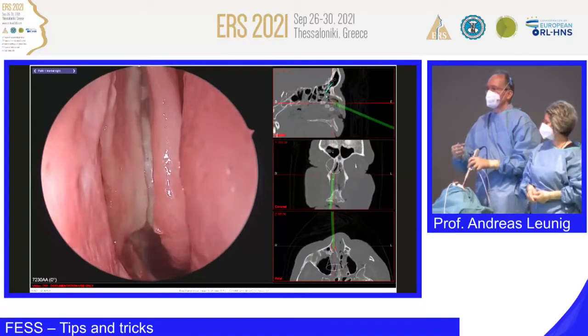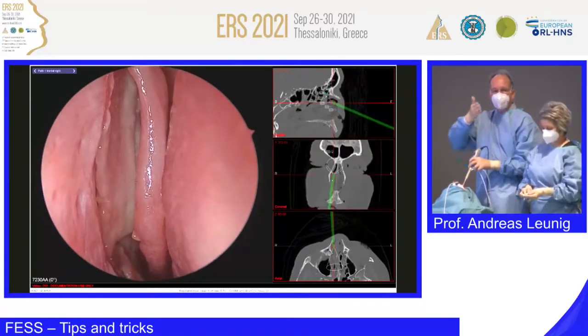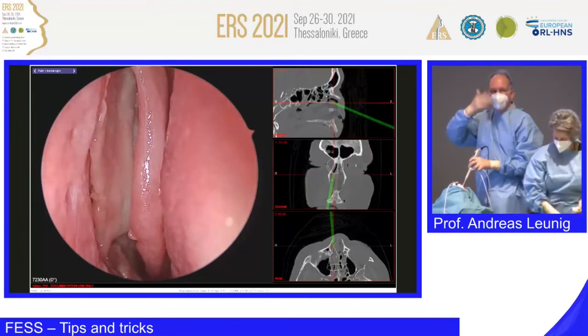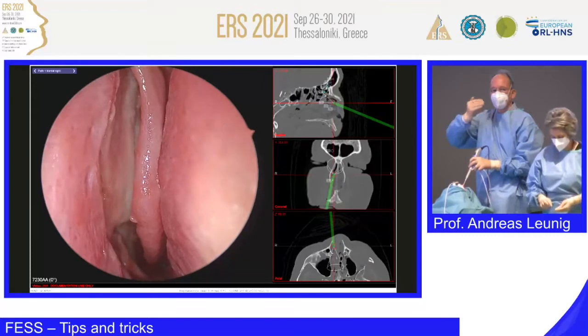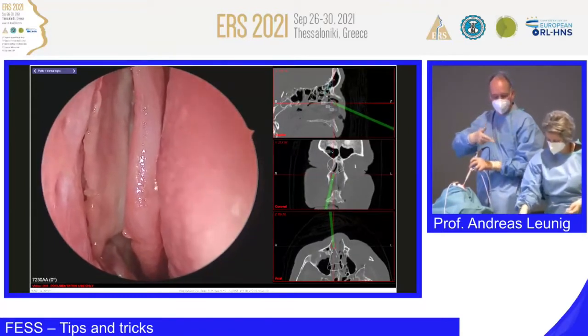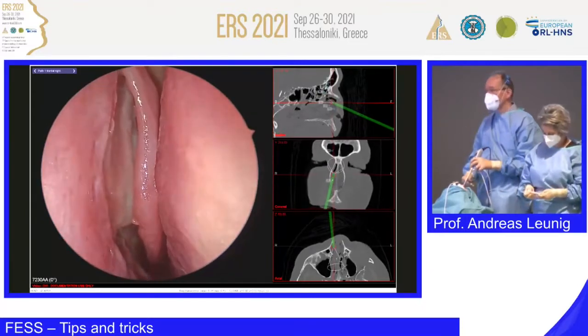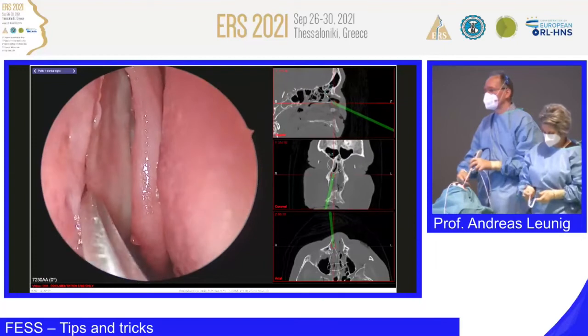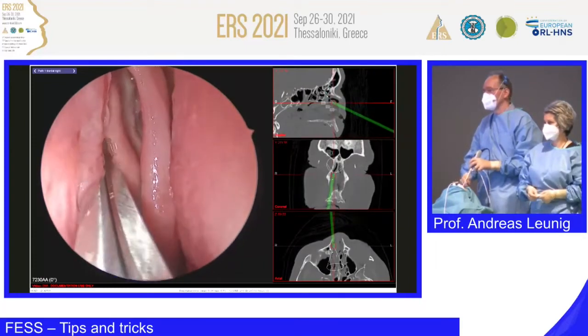And now to take out the uncinate process, there are different techniques. You can use a sickle knife to do it stripe-wise. You can strip, pull. Please don't strip mucosa, very important. Now the scissors, the fine one. What makes sense, and this is what I learned, is to use some clear cuts, as long as you understand where you are.